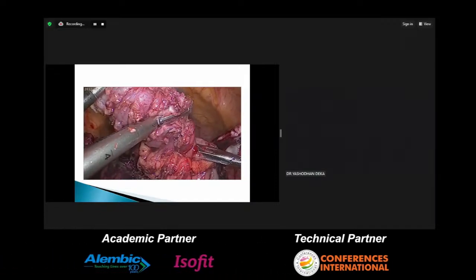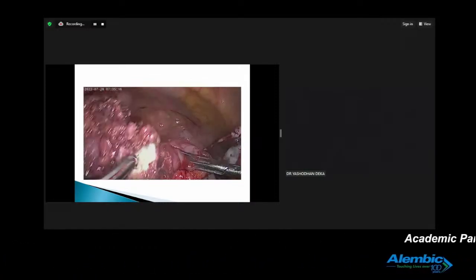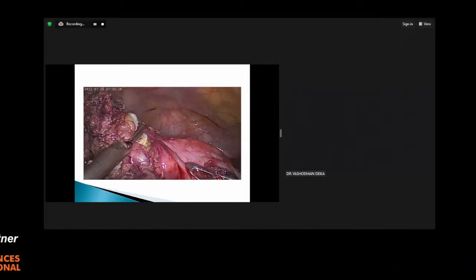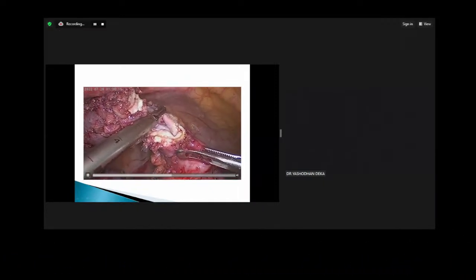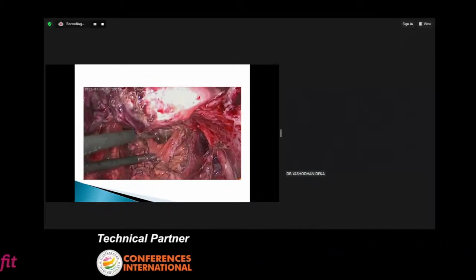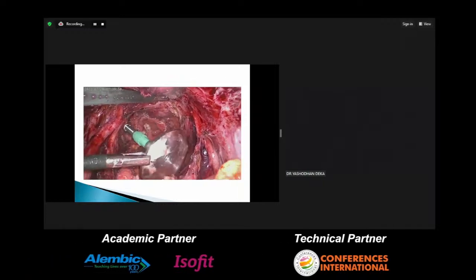This is the proximal part. You have to palpate it, and then you divide it, so you divide it completely, and then you deliver the segment through the rectum. So that is a natural orifice specimen extraction where there is no laparotomy done. Then you introduce the anvil through the rectum. The distal staplers are fired.